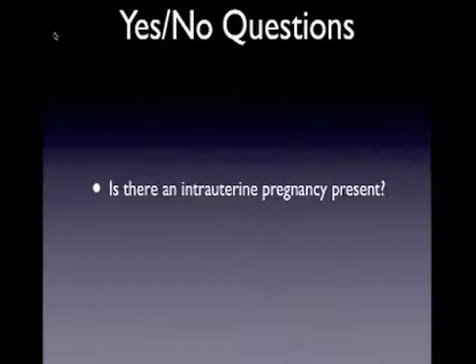In a patient with a history of hypertension and hypercholesterolemia who presents with flank or back pain, a AAA is at the top of our differential diagnosis. Our focused ultrasound question would be, is there a AAA?